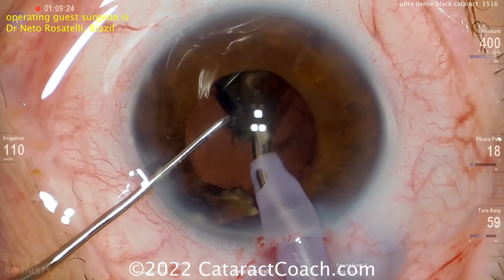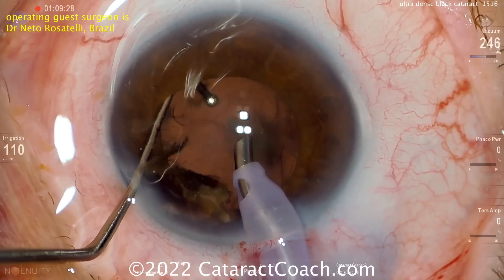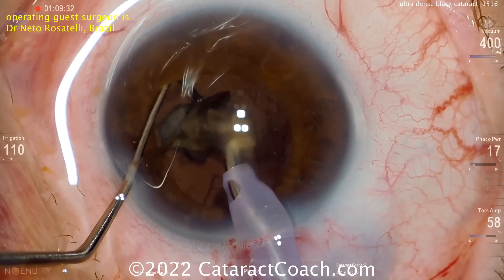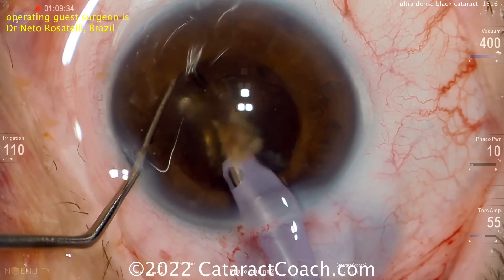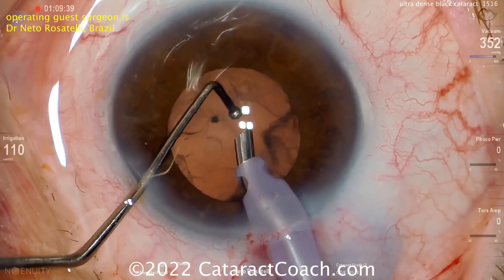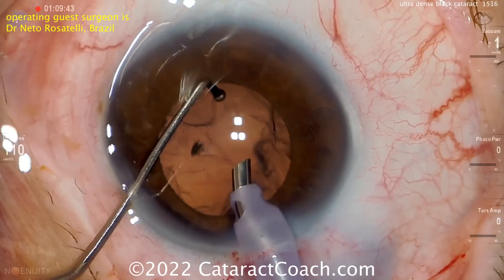With an expert surgeon like Dr. Rosatelli, who's done tens of thousands of cases — I wouldn't be surprised if he's coming on 100,000 cases at this point — he's a very prolific surgeon. But even then, he's taking his time. There's no rush here, so learn from this. We're showing you the video a little edited; this is taking him at least twice as long as his routine case.